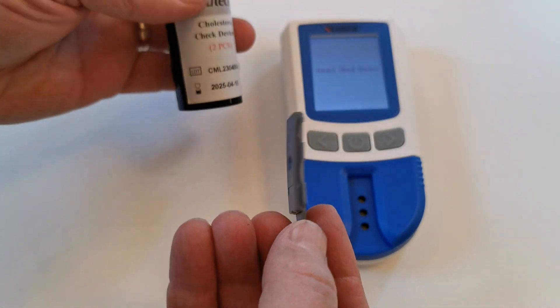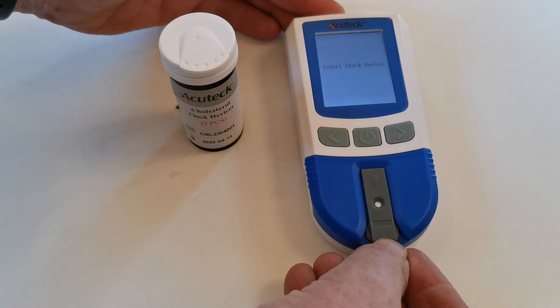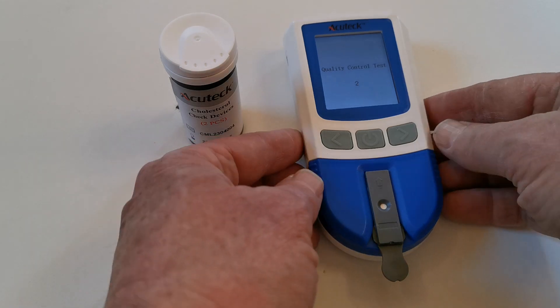Remove one from the pack and close immediately, and insert into the meter as you would with a normal test strip. Quality control test will now automatically commence.